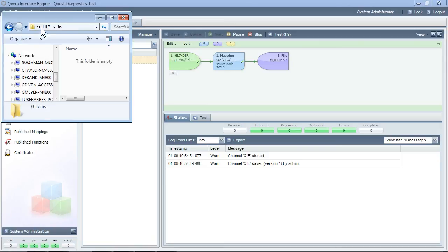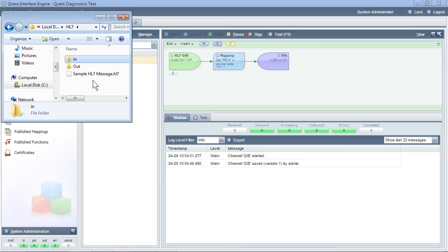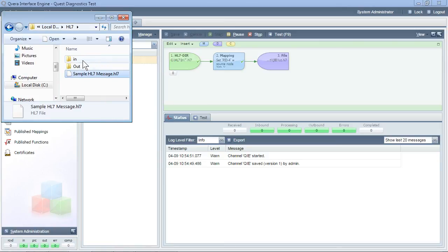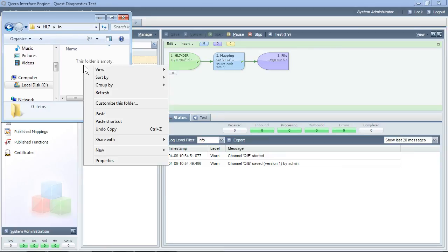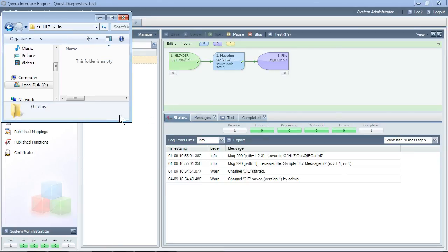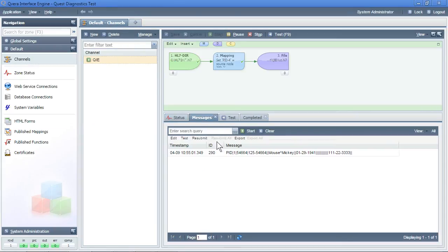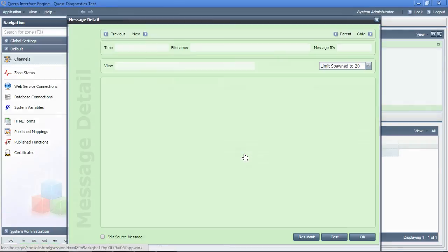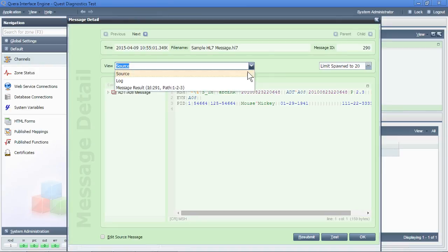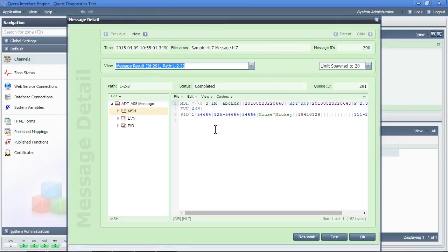We will now take the same sample message and put it into the inbound directory. QIE will pick up and process the message. We can now verify that these changes have taken place within QIE. We have message history here showing the source message and the transformed version of the message.